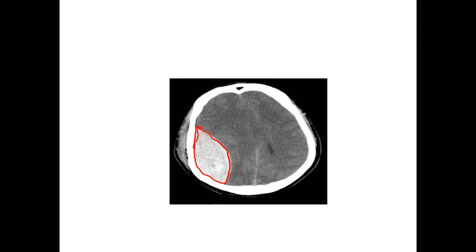So it is convex outward, and it's also convex inward. So it is biconvex. Why is this lesion biconvex?